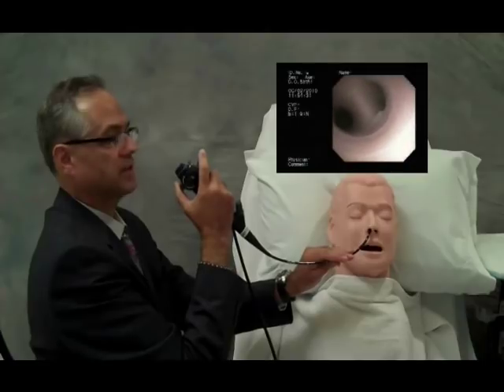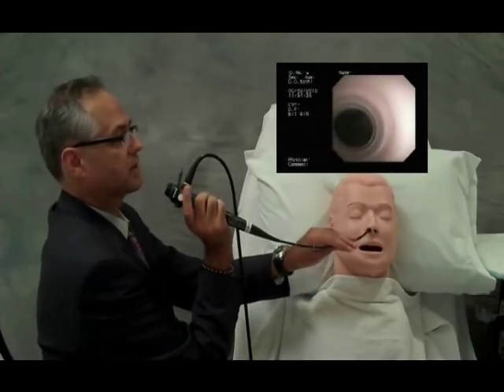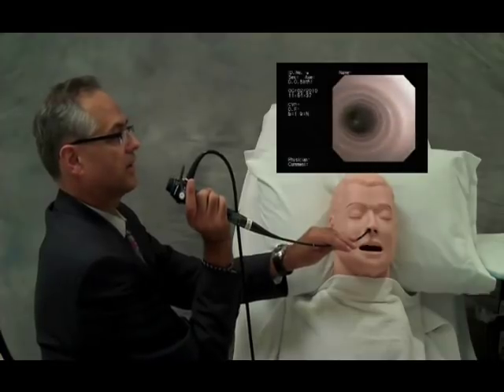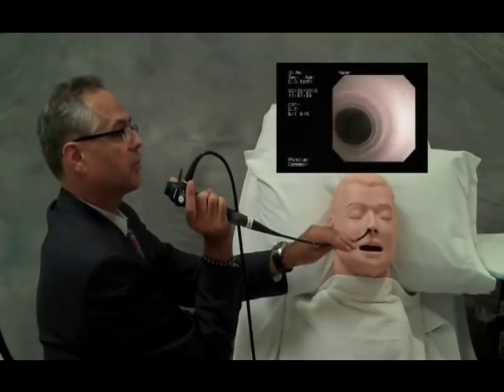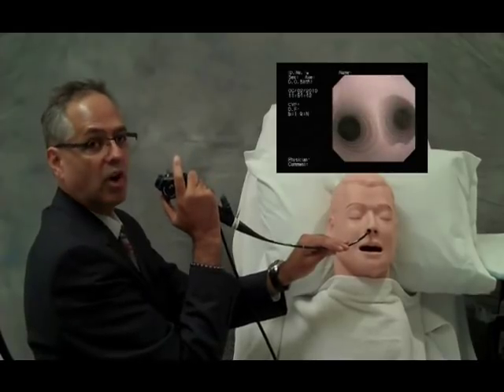Another technique rotates the wrist in the opposite direction, again looking at the left main bronchus and the right main bronchus, the left main bronchus and the right main bronchus, taking care to keep the scope centered and off the wall.